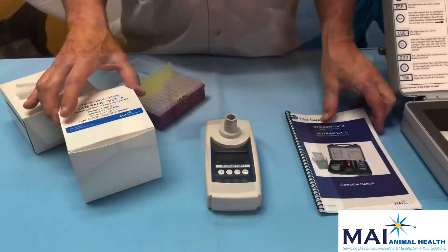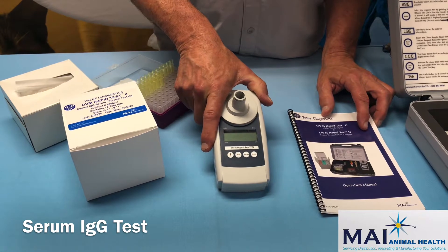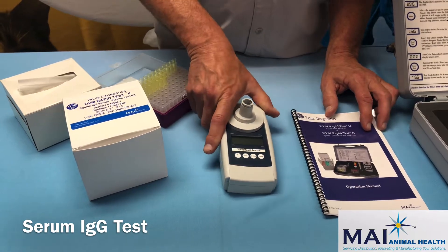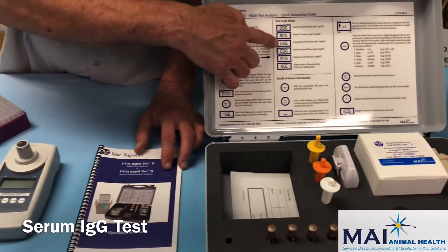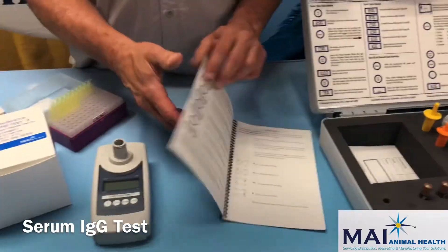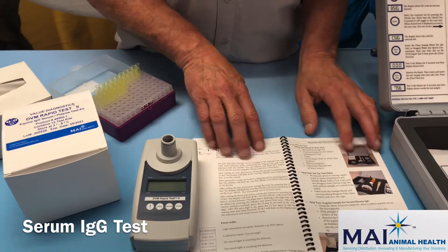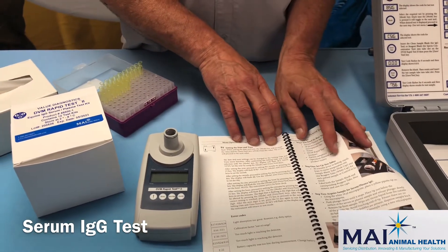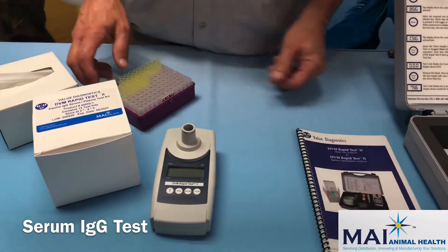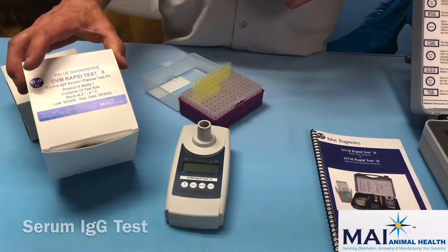The next test we're going to run is a serum IgG test on the DVM rapid test multi-test. It is programmed to run serum IgG tests on equine, bovine, and camelid — each with separate functions listed as programs in your operator manual. There is also a pictorial section in the manual for running the serum IgG test that goes through all the steps required.